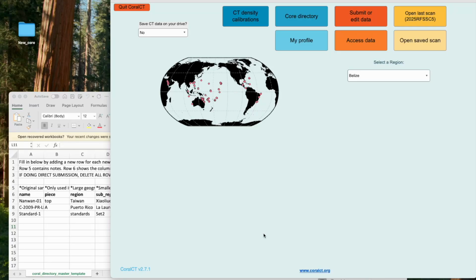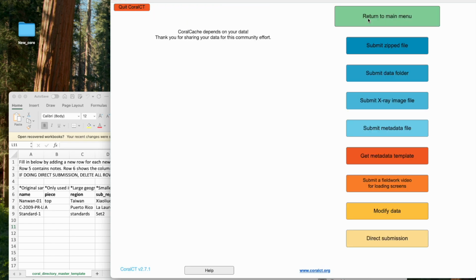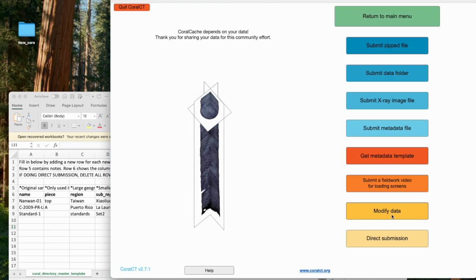This video is going to go through how to use the direct submission option in CoralCT. So from the CoralCT homepage, we'll go to submit or edit data. And then this last option here, direct submission.